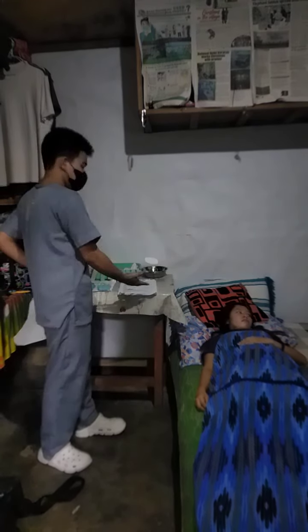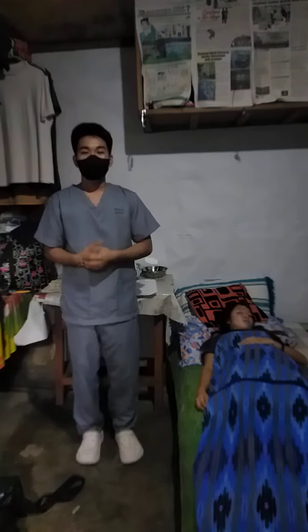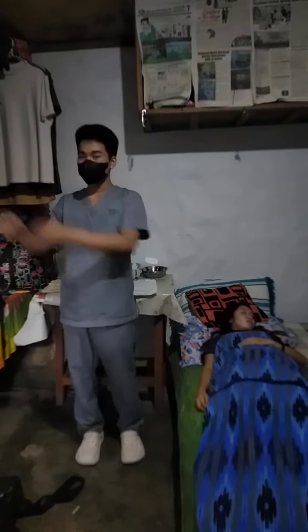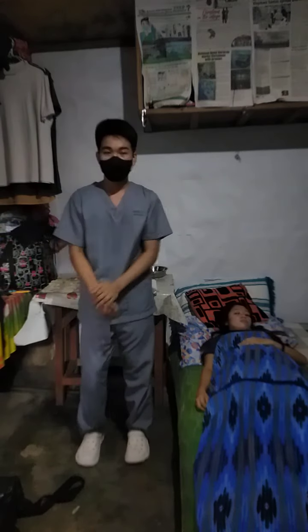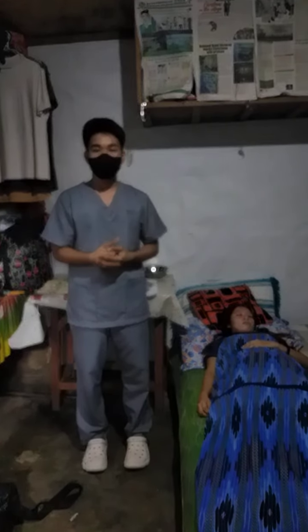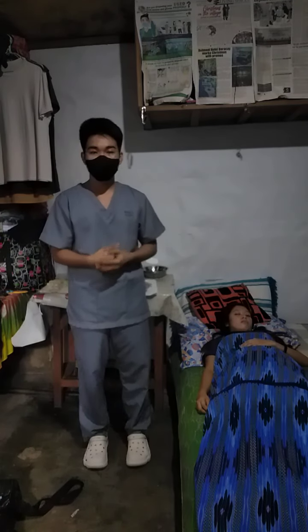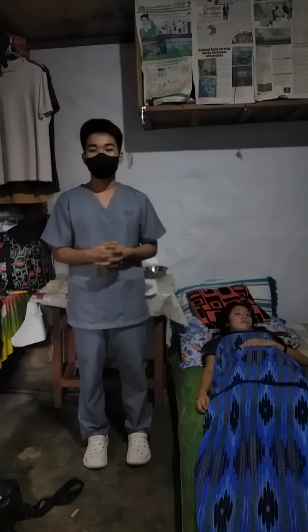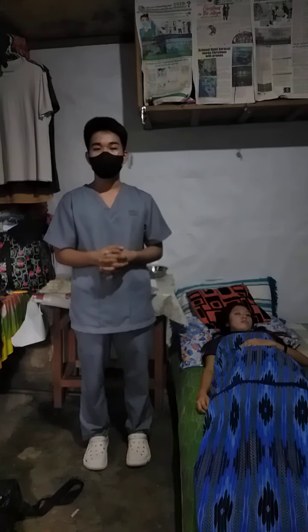So, next is to close the patient's bedside curtain or door to provide privacy. Raise the bed to a comfortable working position. Assist the patient to high Fowler's position or elevate the head of the bed 45 degrees if the patient is unable to maintain an upright position.